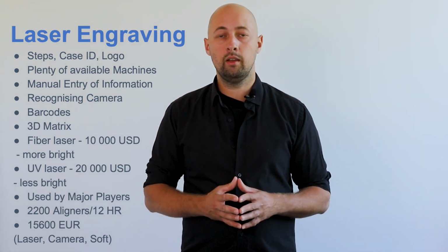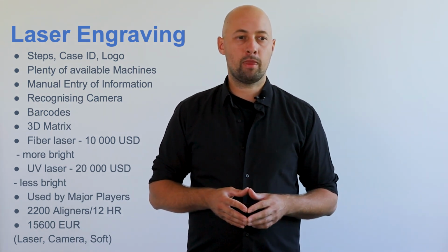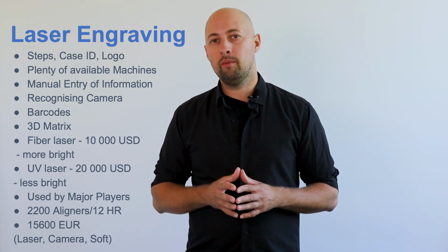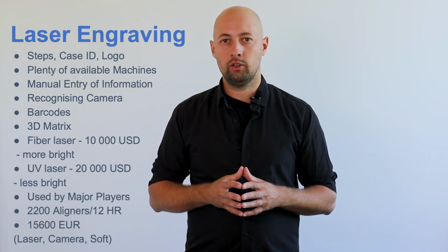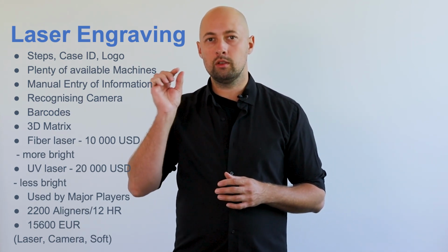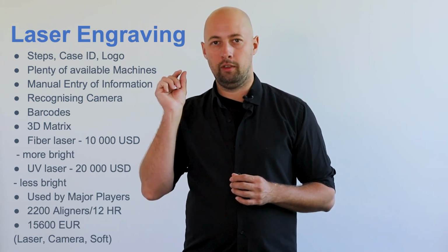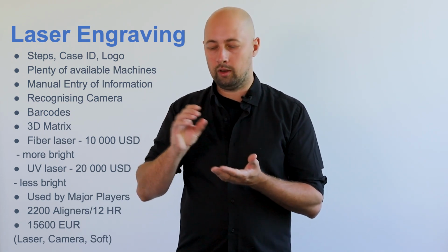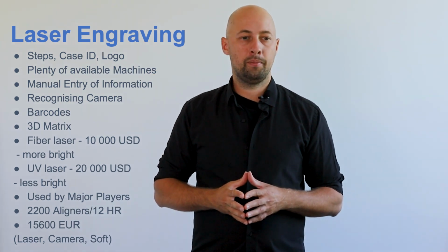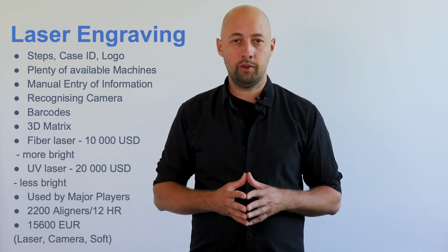In order to do that, you have several techniques. For example, in 2020, I'm sorry, if you watch our webinar dedicated to the aligner production process, you can see that we're using these little steps as the attachments on the molar teeth. So when you vacuum form the aligner, you can have this step number as the attachment. Since then we have evolved, we are now using laser engraving.